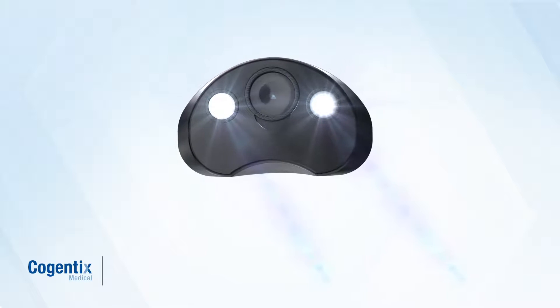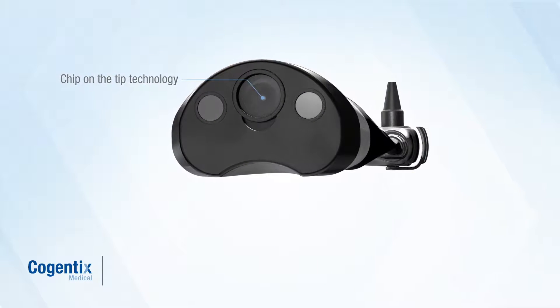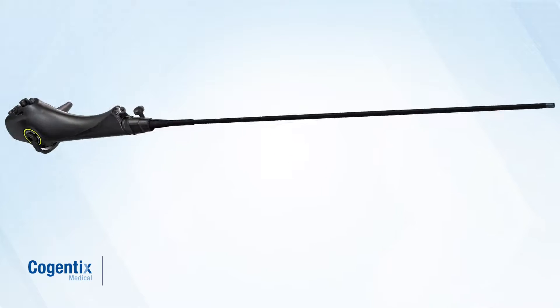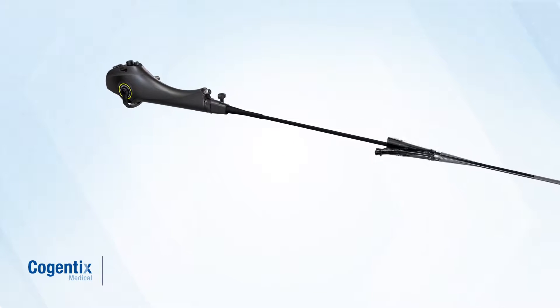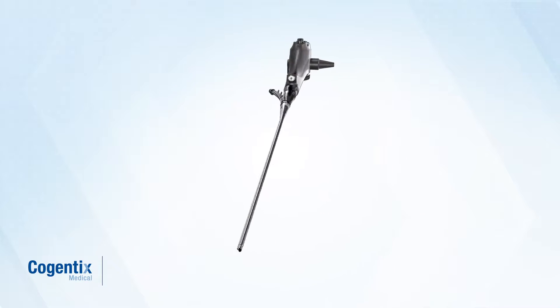The digital cystoscope employs chip-on-the-tip technology that integrates with Cogentix Medical's digital processing unit. Always ready cystoscopy, always sterile Endosheath technology.